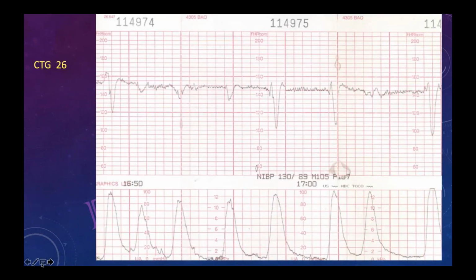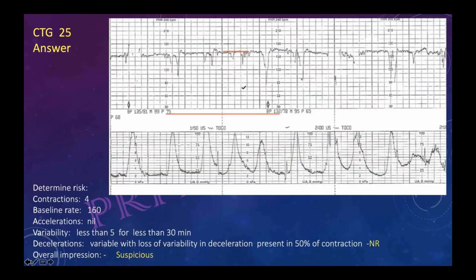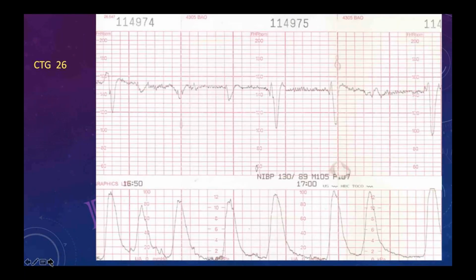Madam, all of the traces are less than 30 minutes. And when are we going to comment on anything that is above 30 minutes?